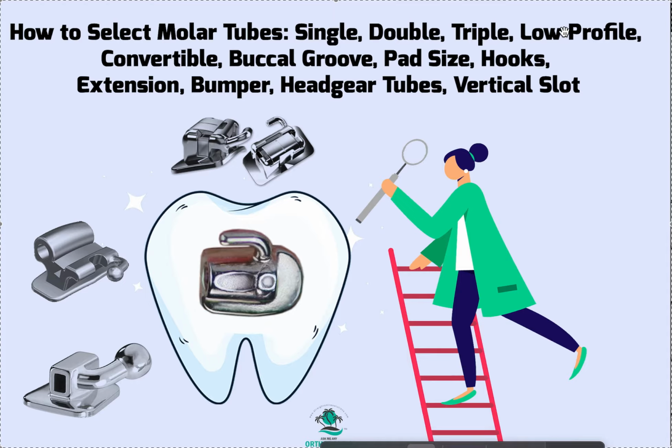Low profile, yeah, that's a no-brainer. If you have a choice of low profile or high profile, why would you get high profile? It's just going to be more uncomfortable. So low profile, it's just a marketing gimmick. Convertible, no, it's not like a Mustang or a car.